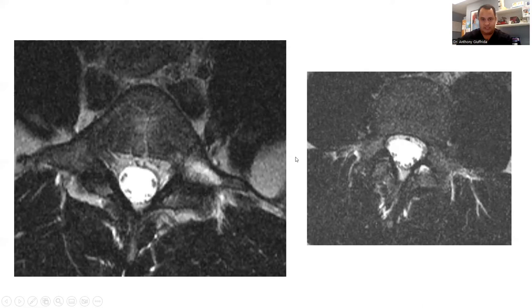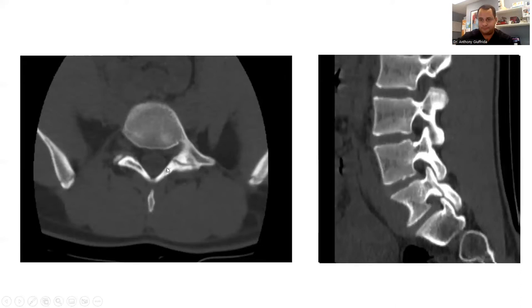The decision at that time was to get a CT scan to see if there was a full through-fracture. This CT scan was obtained a few weeks later, and we see the L5 pars defect right there. Obviously, no movement on flexion-extension views — I have those as well and they're normal.